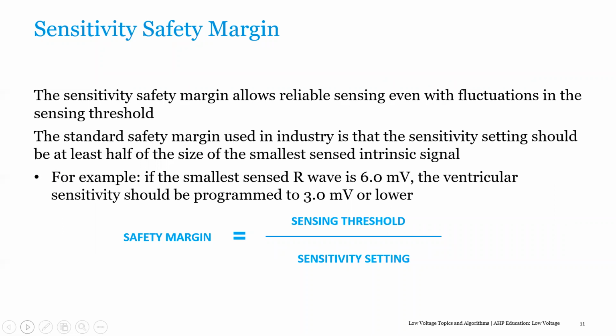P waves are a little bit different. P waves are a little smaller just by nature. So we're looking at implant for P waves over 1.5 millivolts. So our sensing threshold will be much lower. If you all follow that. If not, please jump in.